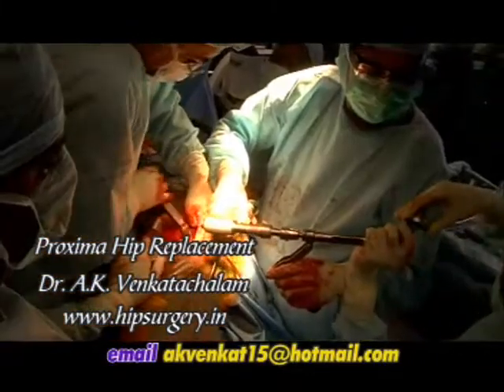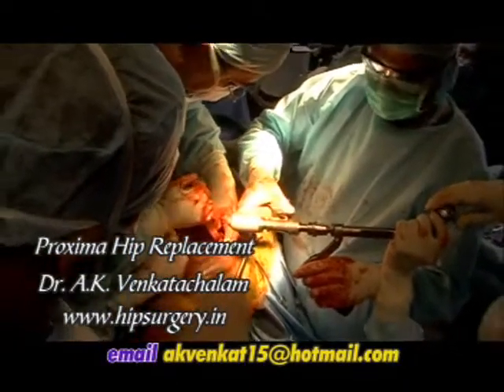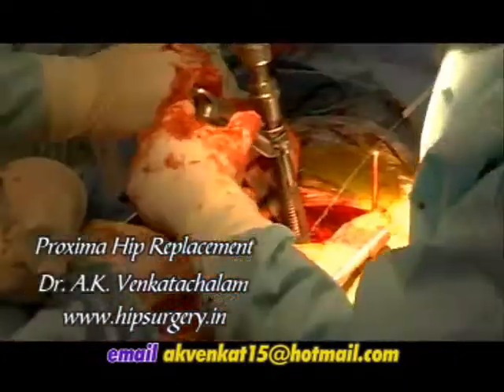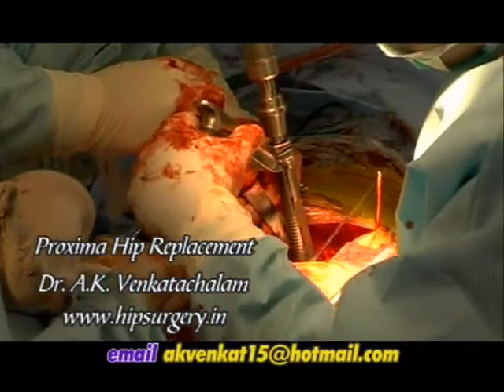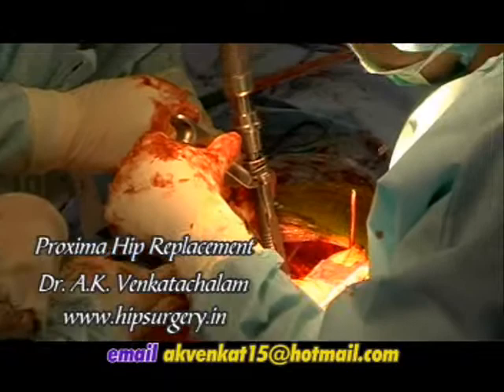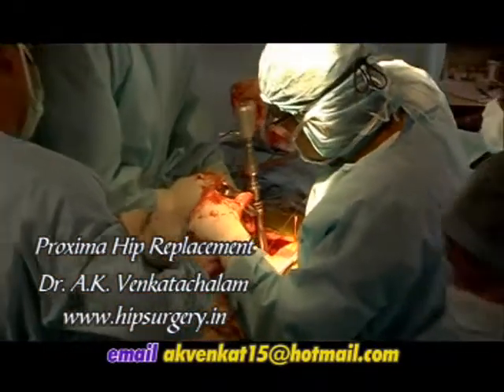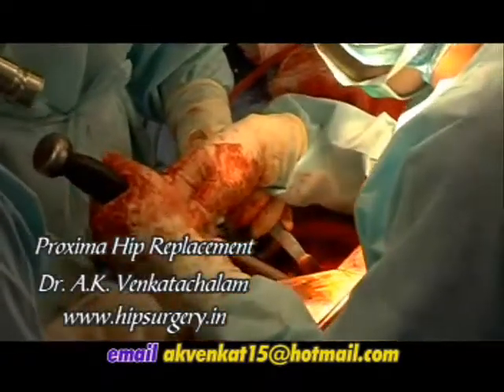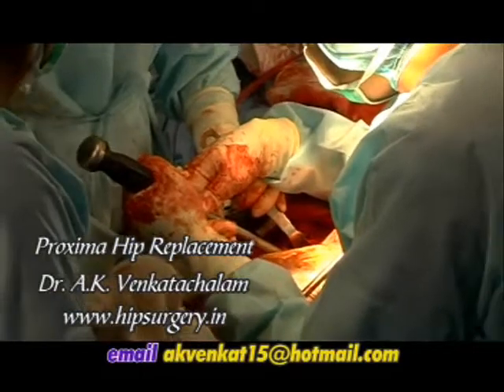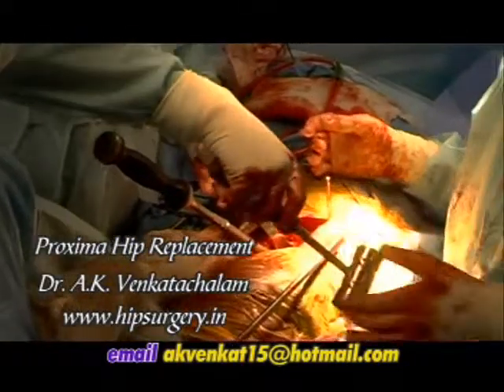Reaming proceeds in 1 mm increments until the measured size on the template is actually reached. All reamers should be introduced in 45 degrees of abduction and 15-20 degrees of anteversion. When reaming has been completed and all the cartilage removed from the acetabulum, a trial cup is fitted in.